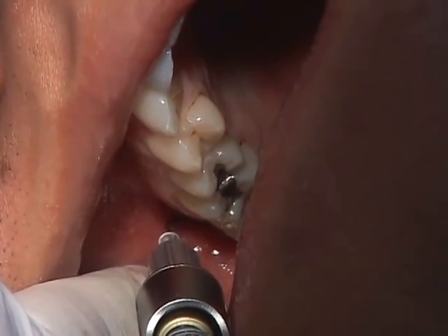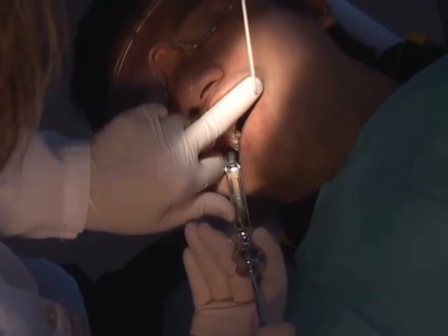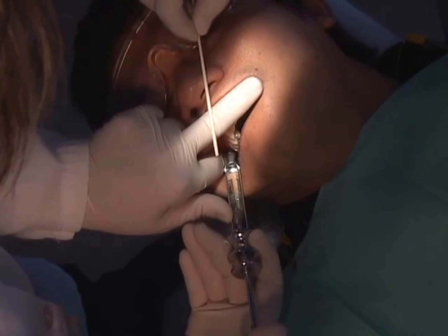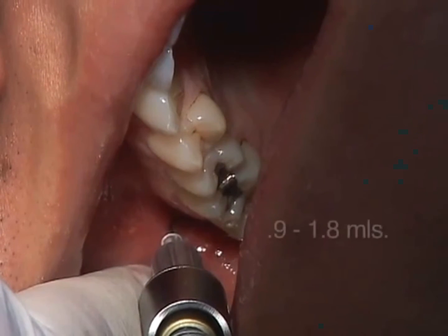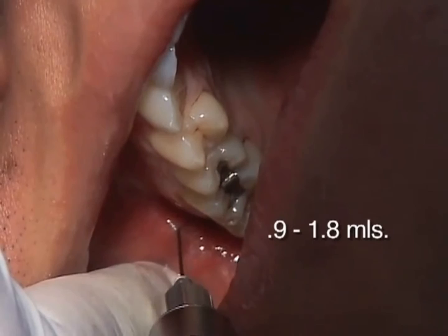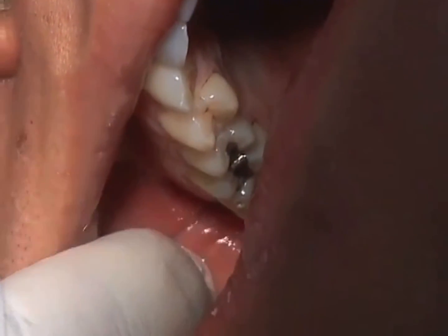Note the syringe angle. To achieve the 45-degree angle towards the mid-sagittal plane, visualize that the needle tip is directed towards the inner corner of the eye on the opposite side of the injection. After depositing 0.9 to 1.8 milliliters of solution, withdraw the needle and safely recap.